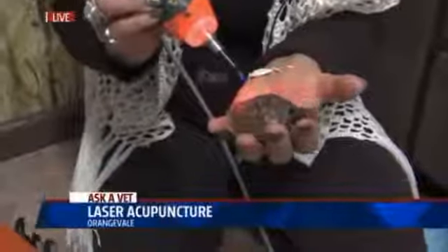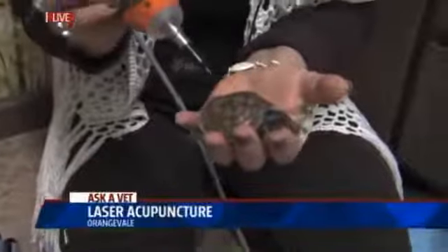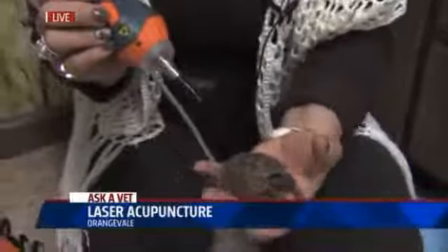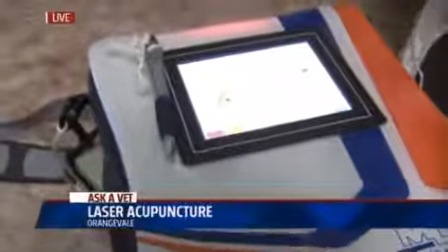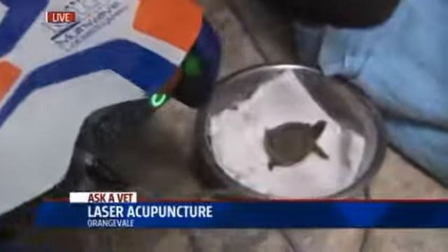We saw Harley down there and he was kind of moving around while you were doing the laser pointing on his back. Does it still work as well if the animal is moving a little bit? Yes, absolutely. This is a portable laser too — you can bring it on house calls now. We used to have one that we couldn't move around, but this one actually packs with us everywhere we go. So as the animal's moving, if they feel uncomfortable, we can just move right along with them. That's why I'm sitting on the floor today.